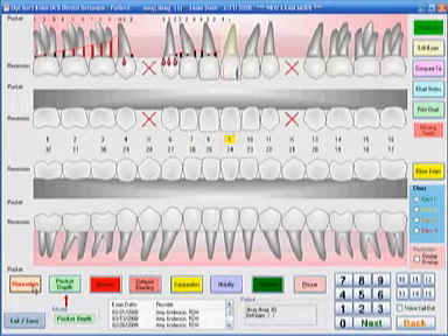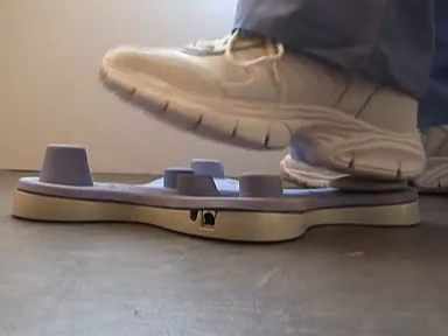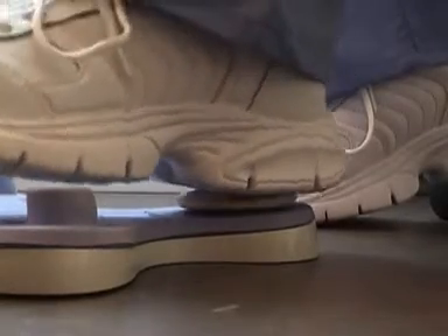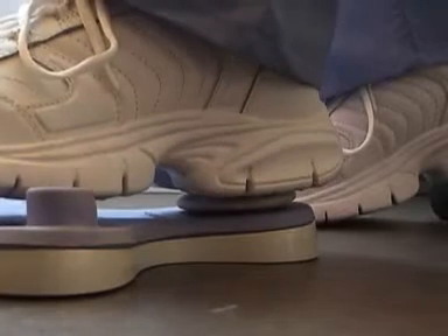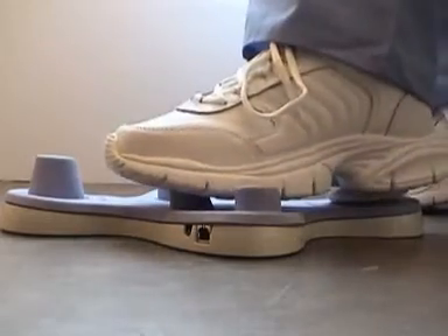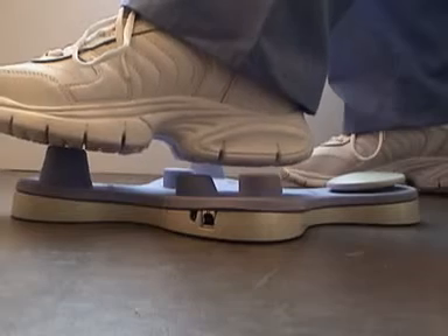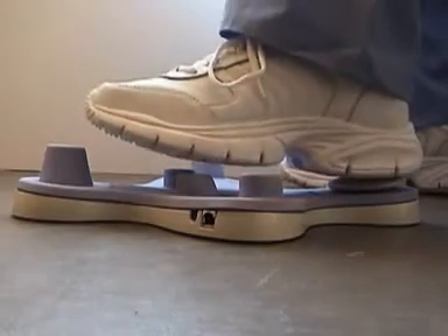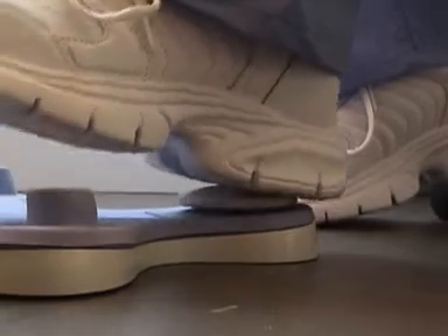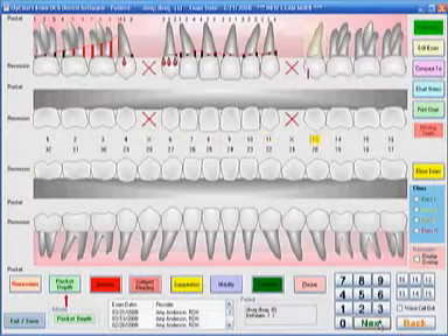Now if you make a mistake, which can happen, go over and take your mouse to the word that says 'back' in the lower right portion of the screen and go back to the number that you made the mistake on. Let's say the mesial of nine was only supposed to be a two — I'm now on the mesial of nine and I enter the two. I can take my mouse over to 'next' and then click with my heel, and every time I rock back on my heel it advances. So I can go back to where I was prior to the mistake and continue Perio charting.